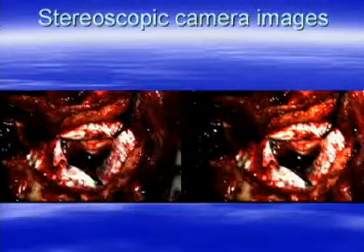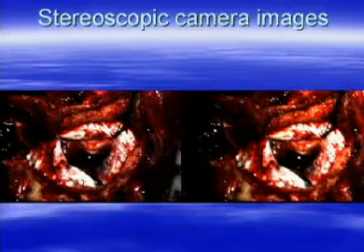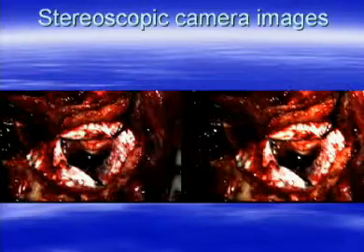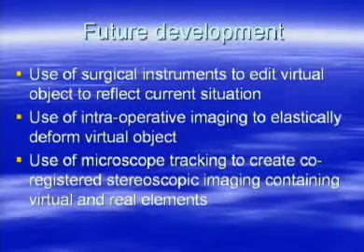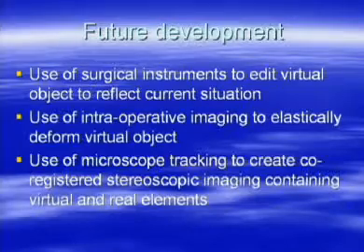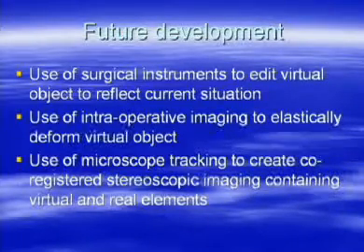This is the type of situation where we have stereoscopic images coming out of the microscope system. Again, you cannot appreciate these unless we had the particular projection system, the combination of that. But now we are actually talking about the combination of the virtual and the real. We're actually flipping back and forth between the virtual and real very seamlessly.